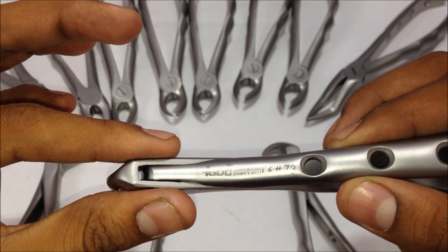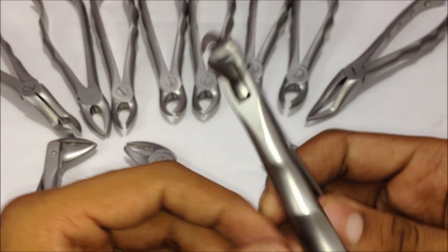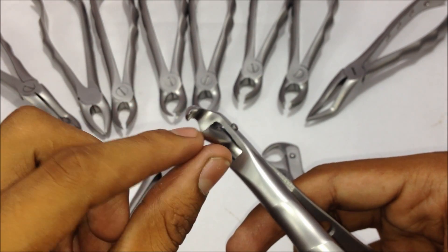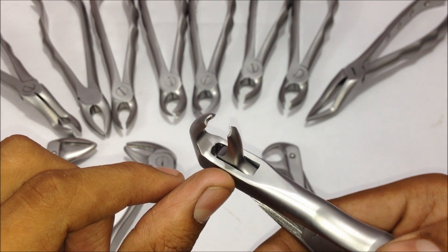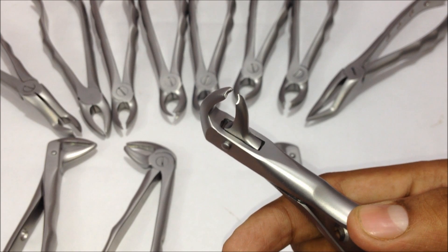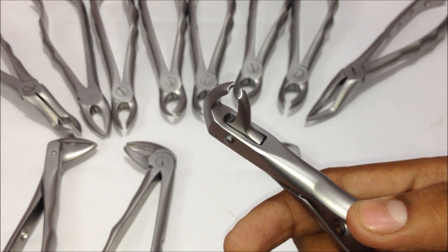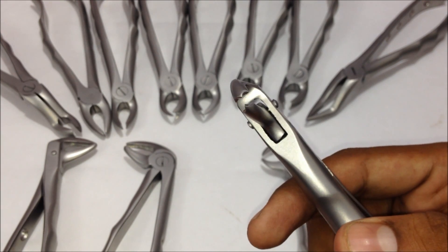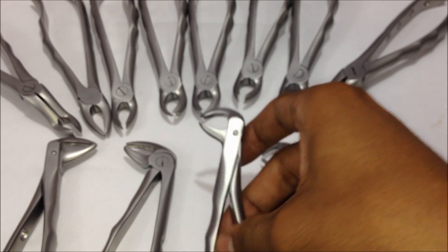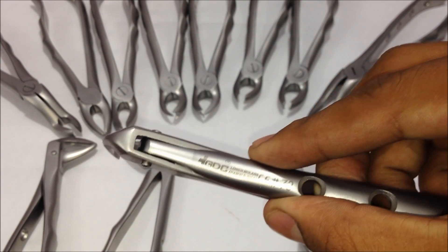The next one is the lower molar forceps — the hawksbill. It has two big beaks on both sides with pointed edges. Since there is no difference between left and right molars in the lower jaw, this single forceps can be used for both left and right molar extractions. This is the number 73 extraction forceps.